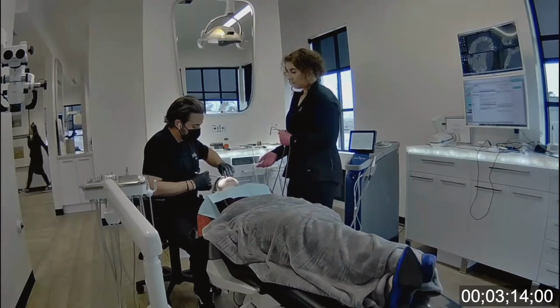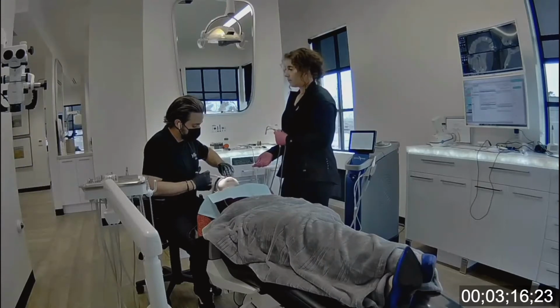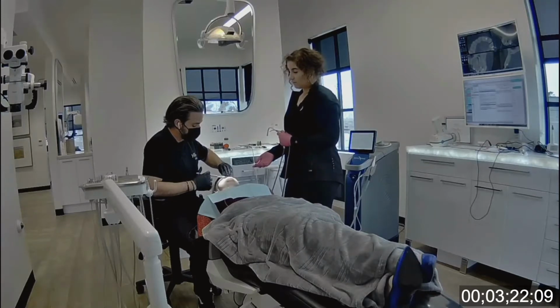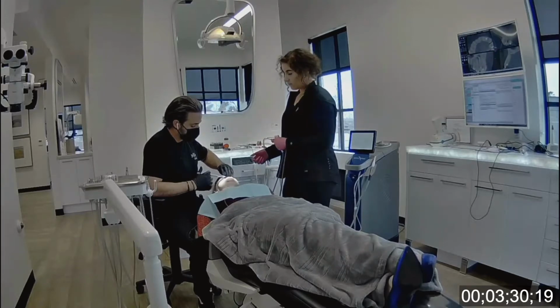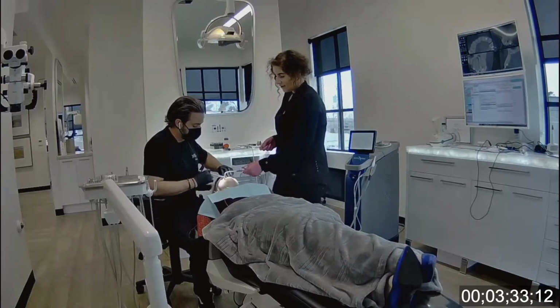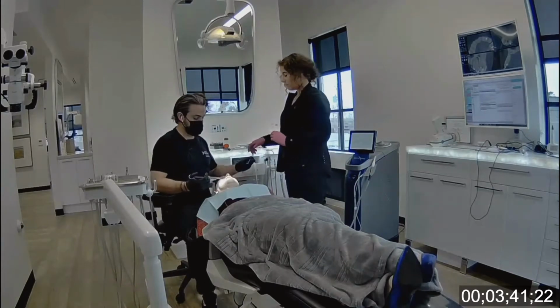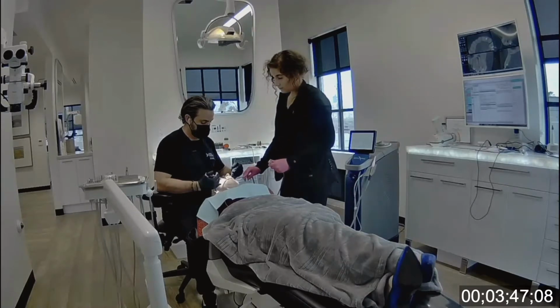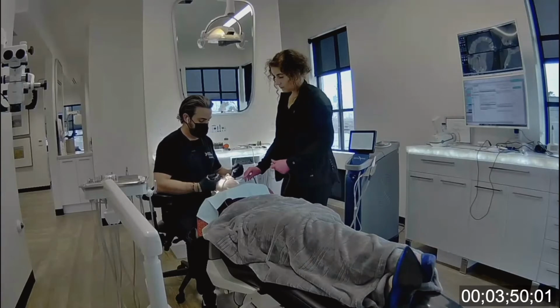Now, one of the ideas that we have with doing these sort of live procedural feeds is showing you a variety of everything. The wish is to start with just this anterior, and we'll talk about how I do the technique, and then a molar, and then we'll actually do a retreatment as well. Not all today. And I'll give you a wrench in just a moment. Okay, let's have you open wide. Nice and easy here.